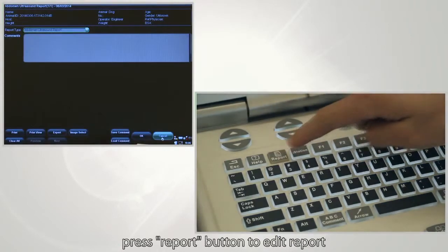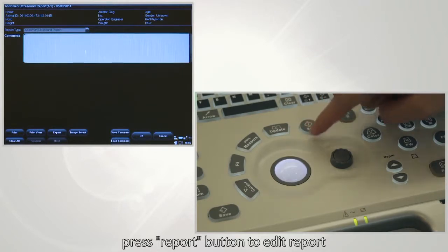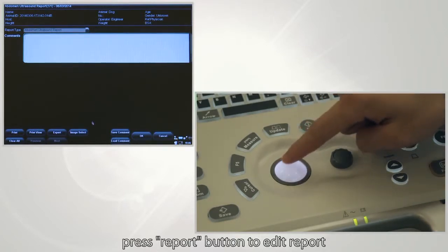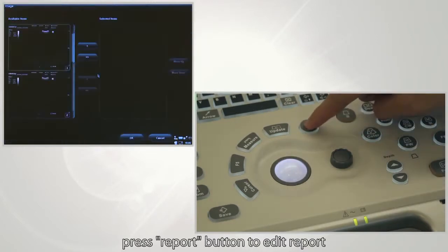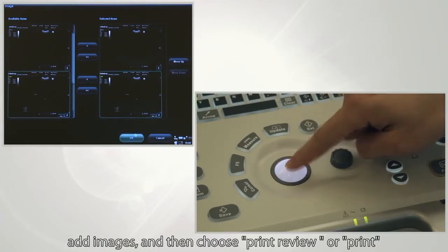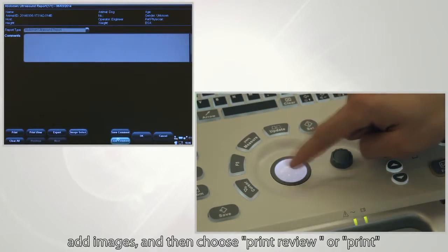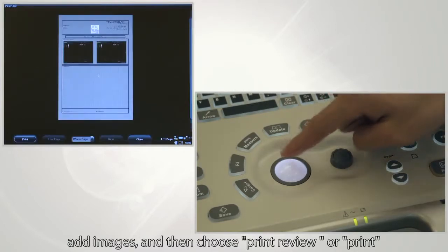Press the report button to edit the report, add images, and then choose to print or review.